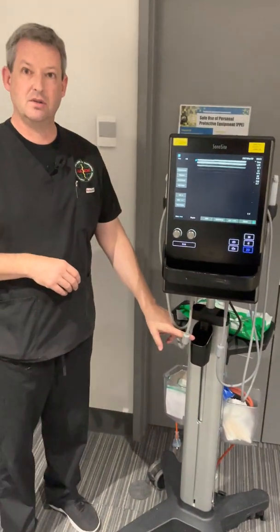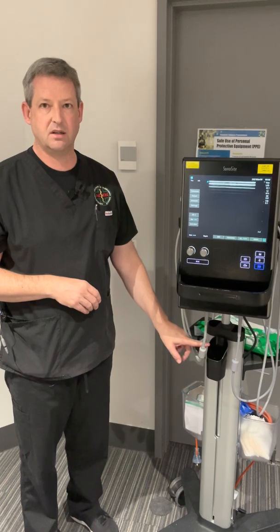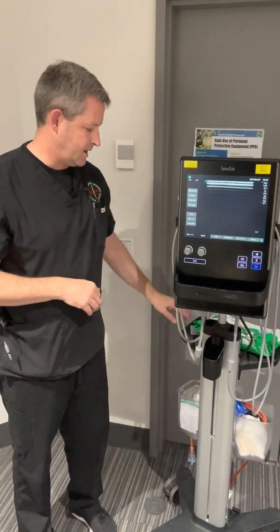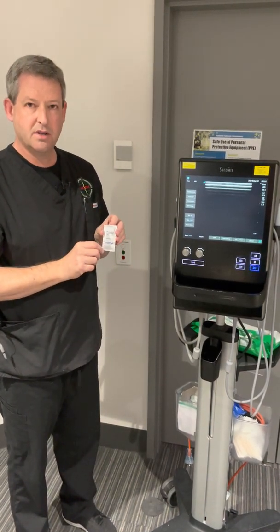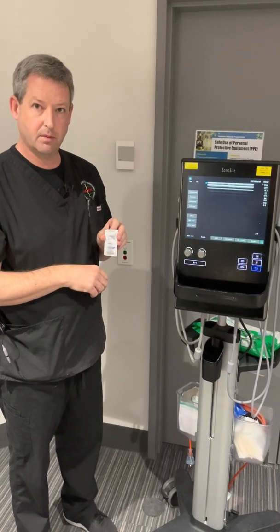A general use gel bottle will be here, noting that this is non-sterile gel and shouldn't be used for the procedure itself — it's more for survey scans. Access to sterile gel will either be in bigger packets, or surgery lube in every cubicle, which is actually sterile gel that's suitable for performing procedures.